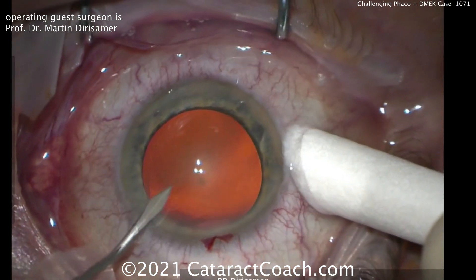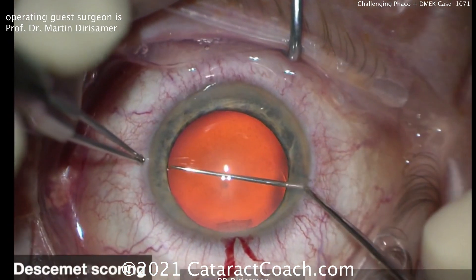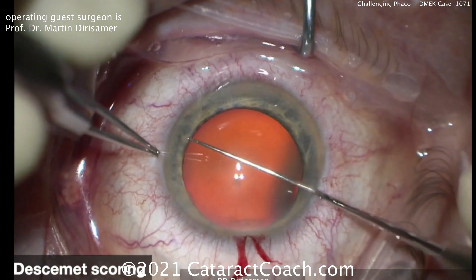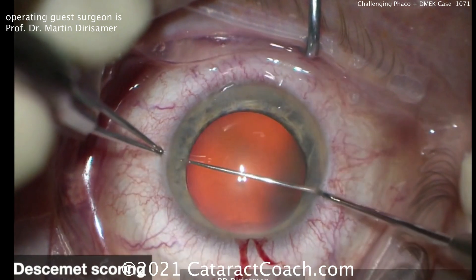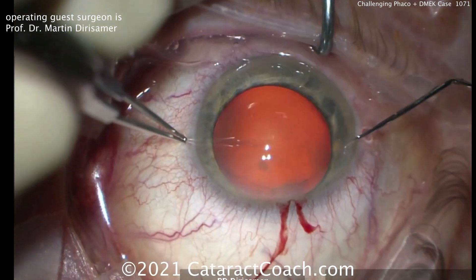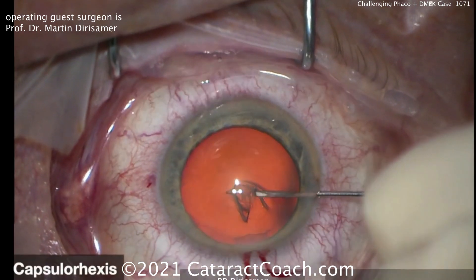This is a patient who had prior LASIK, has a cataract, and needs an endothelial transplant. At the beginning, it's just scoring Descemet's layer using that reverse Sinskey hook through a paracentesis, and Dr. Derisamer makes it look easy.